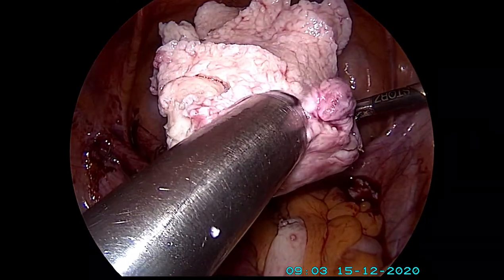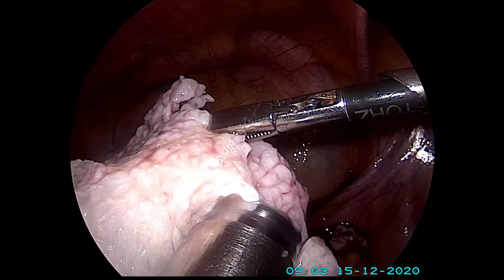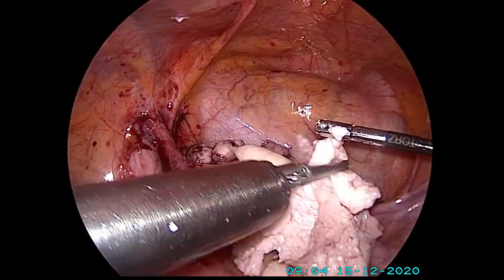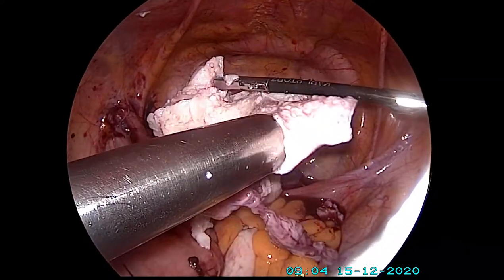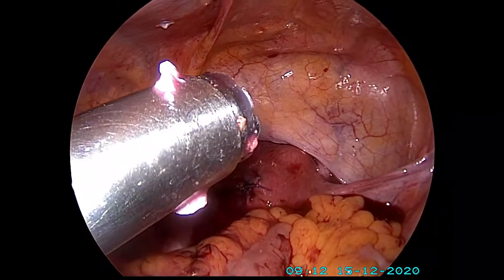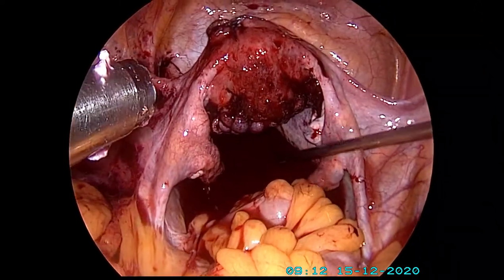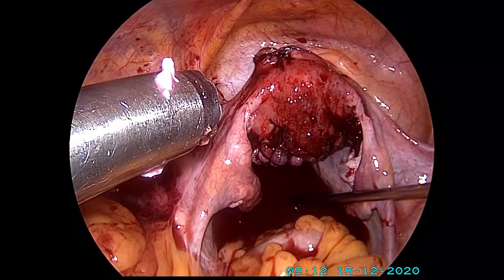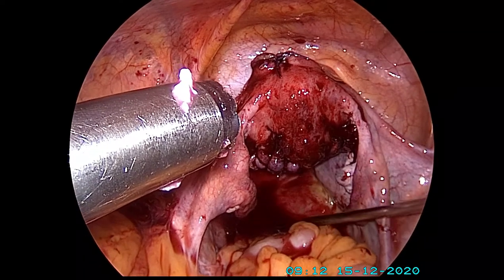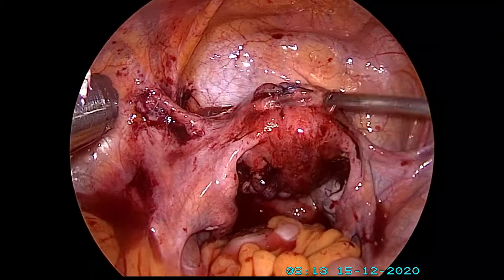These are extremely bulky instruments and definitely leave the surgeon with very painful wrists at the end of the procedure. There you have it — that fibroid is getting smaller and smaller with more chunks being cut out, and that's all the tissue having been removed. The blade is no longer required; that's the uterus back in shape now. Majority of the fibroids — the big ones — all removed. As I've said in all my other videos, we have to clean up the uterus, ensure that the peritoneal cavity, the uterus, the ovaries, fallopian tubes and the tummy are absolutely cleaned of all the blood, all the debris, all the small little tissues. So we leave a very clean pelvis behind at the end of surgery — it's washed repeatedly with normal saline.